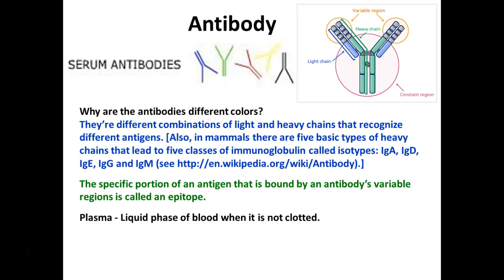When I used to do these types of tests in research, you could run them on what's referred to as plasma, when the blood has been taken with an anticoagulant. When you separate out the red blood cells from the liquid phase of the blood, this is called plasma. Immunologists like myself do not like plasma because it contains not only the antibodies, but also the clotting factors that were not used because the blood was not allowed to clot. These excess proteins can get in the way of these types of tests and cause problems. I prefer, and most immunologists would prefer, to work with serum samples.